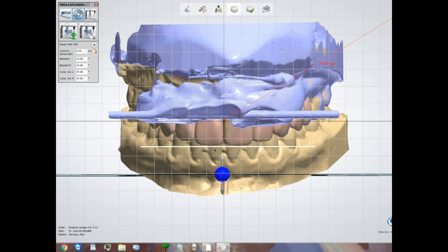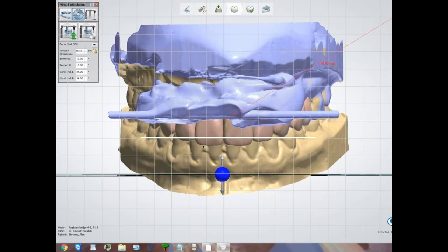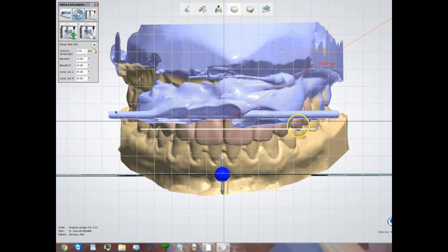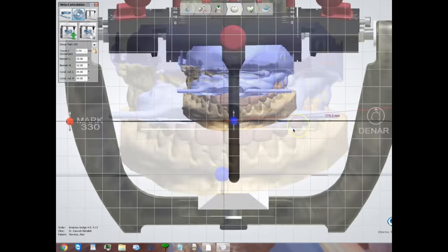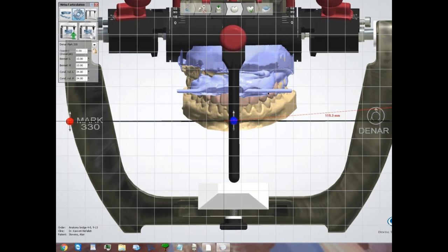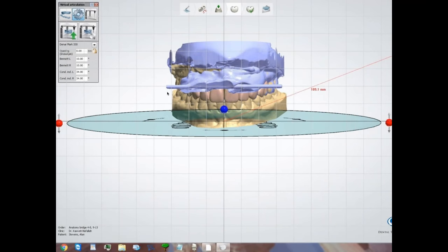Once I have my horizontal axis, I start my smile design. I've got a horizontal for my two centrals, a horizontal for the laterals if they should be the same length, and tip of the cuspids — moving up, I can see all my teeth. With this horizontal ball right in the center of my pin, I know my articulator is square to me. When I fade away the articulator and tilt it down, that arrow should point right to my embrasure if I want it in the middle. The measuring tool is great with the small grid — I can check that the width of my centrals is pretty much symmetrical, draw in golden proportion lines, measure things.